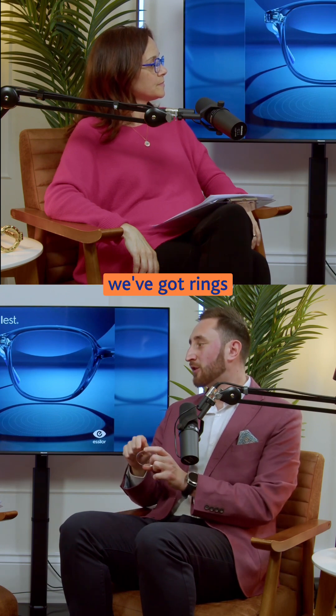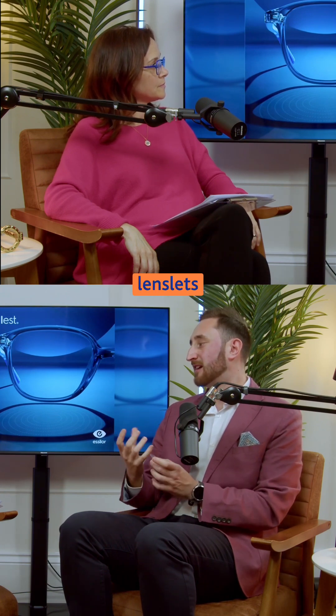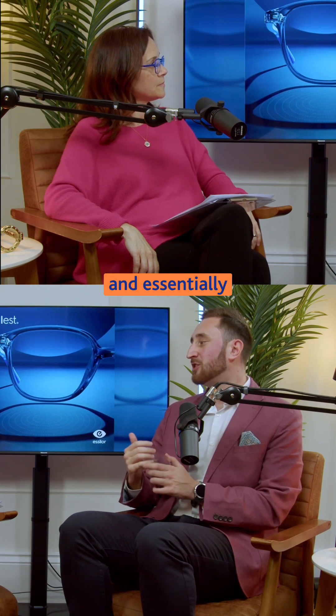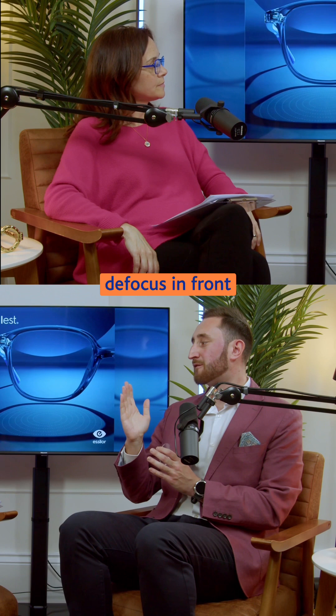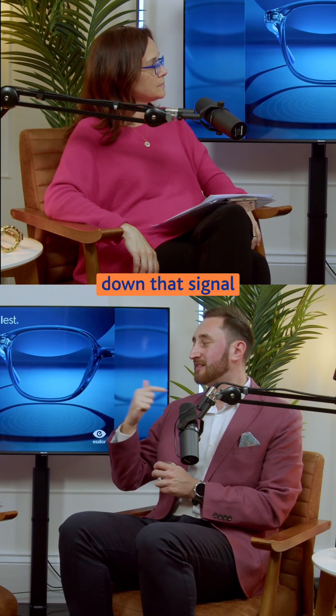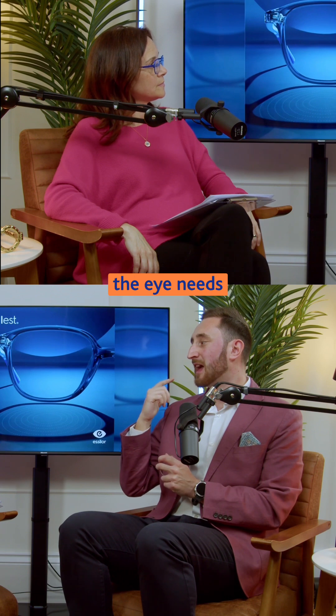In the periphery of the lens, we've got rings of what we call lenslets, and these lenslets have different powers across the lens. Essentially what they're doing is creating defocus in front of the retina, and that defocus is helping slow down the signal to the brain that the eye needs to grow.